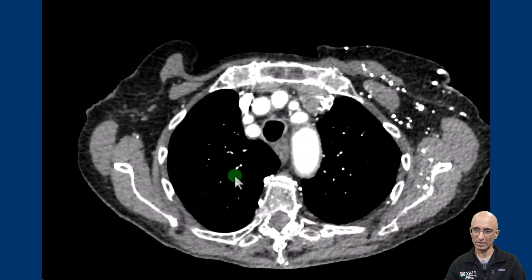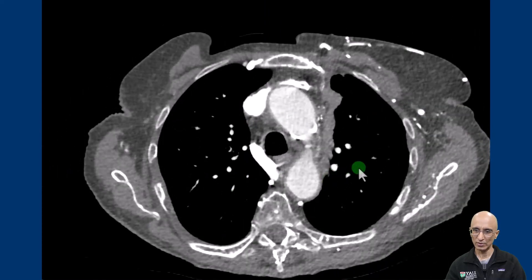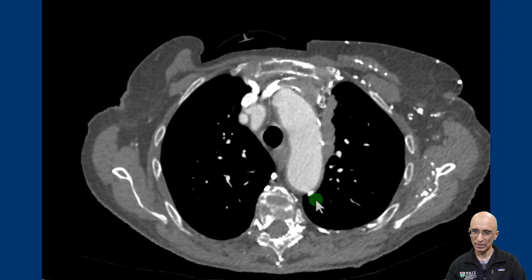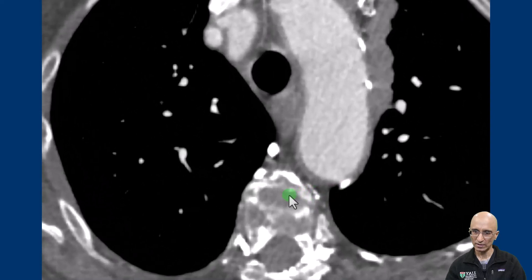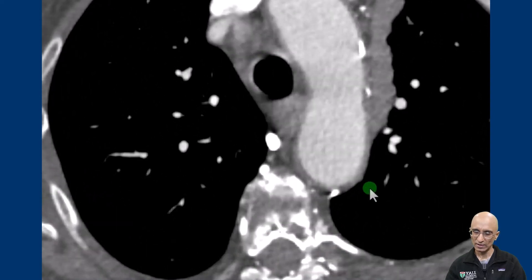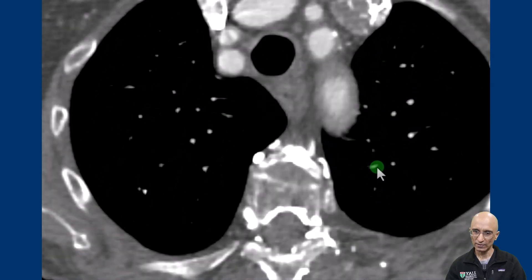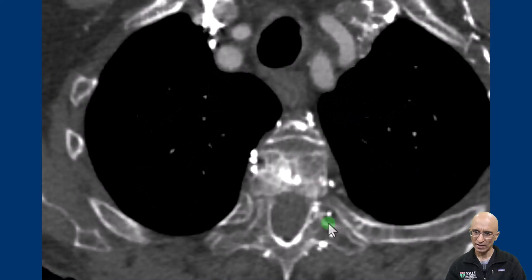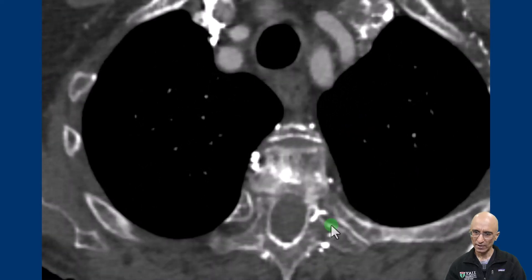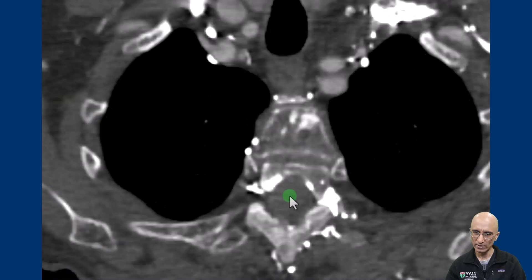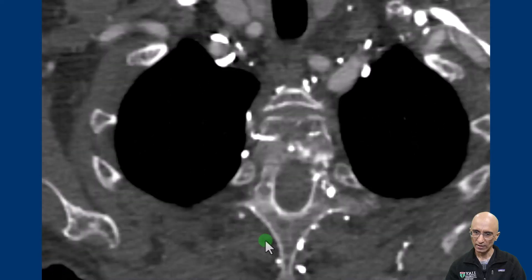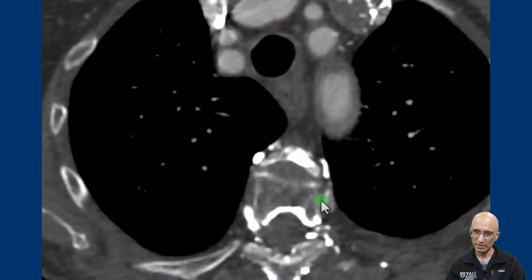This is the original trauma series scan performed with intravenous contrast. These were the sclerotic foci felt to be sclerotic metastasis, but as we closely look at the images — zooming in — we can see there are numerous collateral vessels related to the occlusion of the brachiocephalic vein. As I scroll back and forth, these collateral vessels appear to be traversing through the vertebral bodies. We can also see collateral vessels within the spinal canal and along the posterior aspect of the spine.